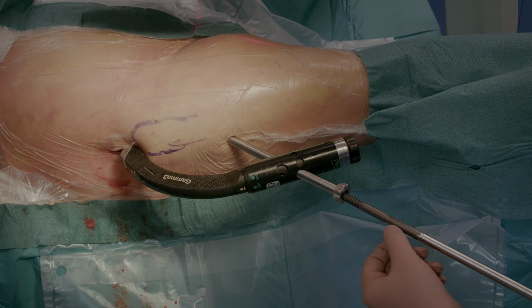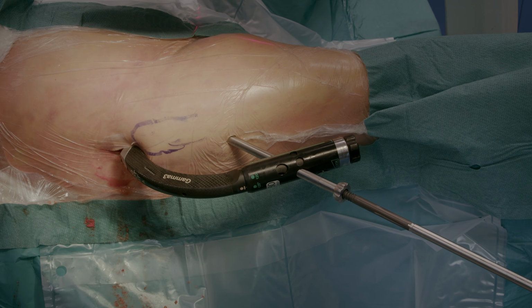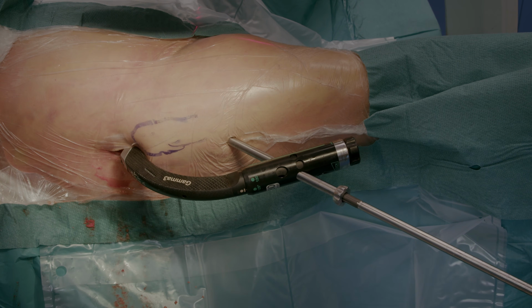These grooves on the screw surface, there are 4 of them on the screw 90 degrees from each other. It needs to be noted that the lag screw should be inserted so that in the end one of these grooves points upwards towards the proximal tip of the nail. In practice, the lag screw insertion handle should be either parallel or perpendicular, i.e. at 90-degree angle, to the target device handle.